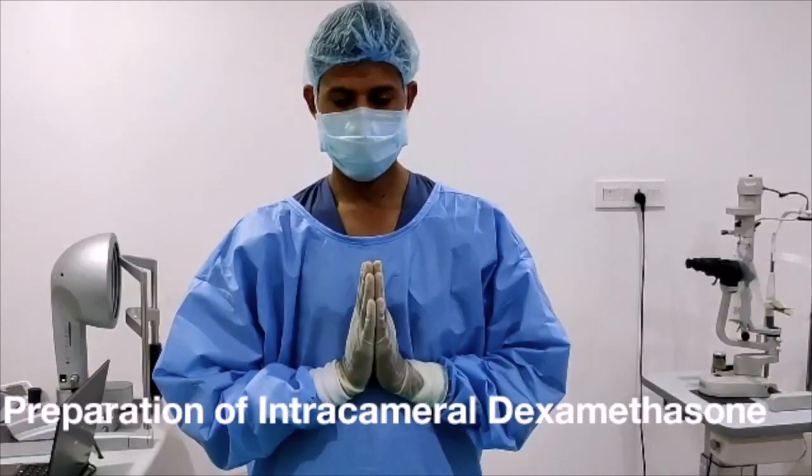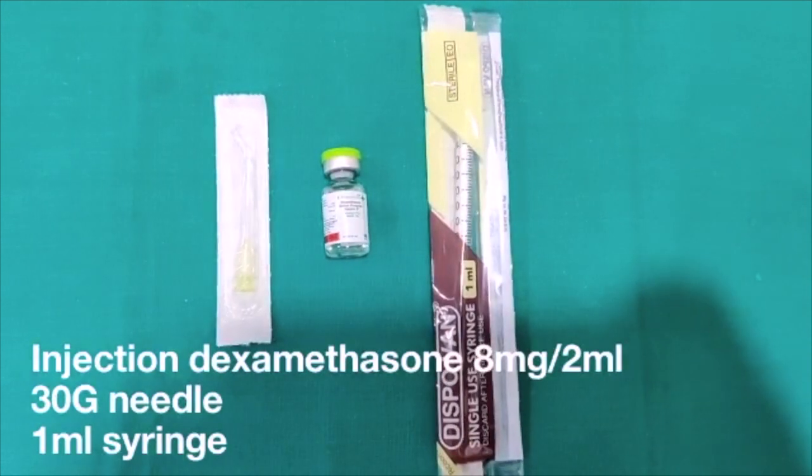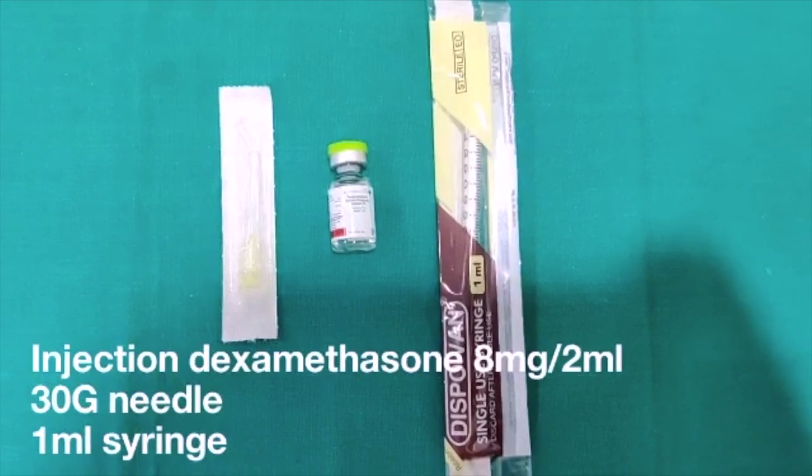Hello all. This video is regarding the preparation of intracameral dexamethasone. For this you need injection dexamethasone 8mg per 2ml, a 30 gauge needle, and a 1ml syringe.